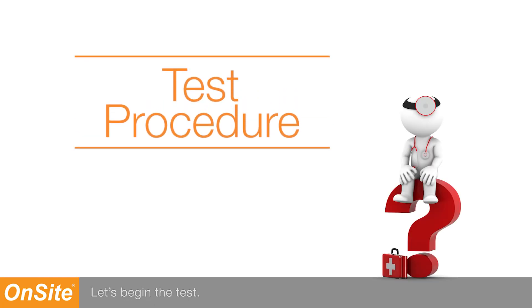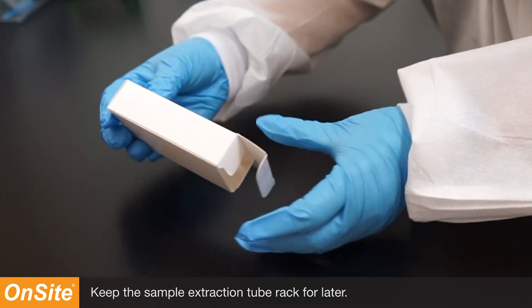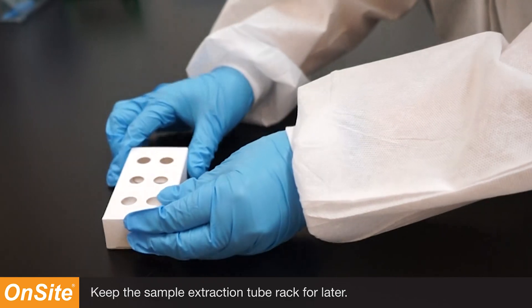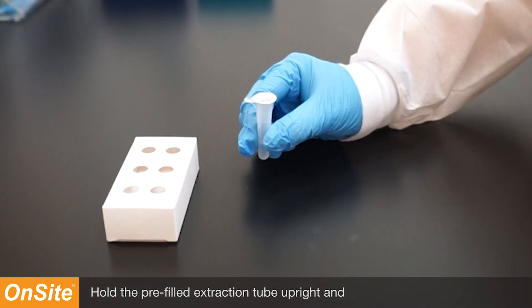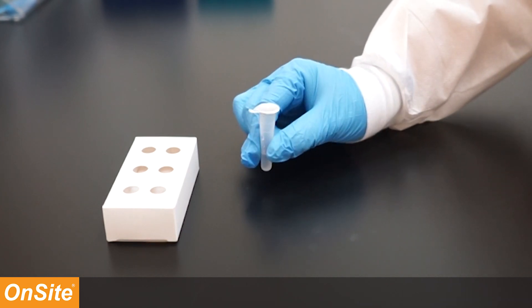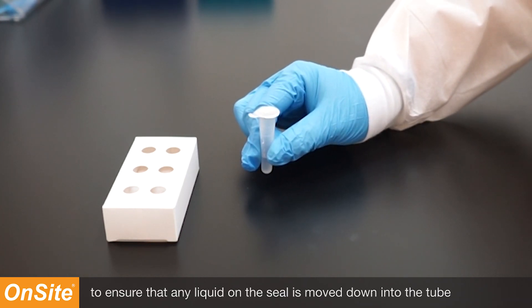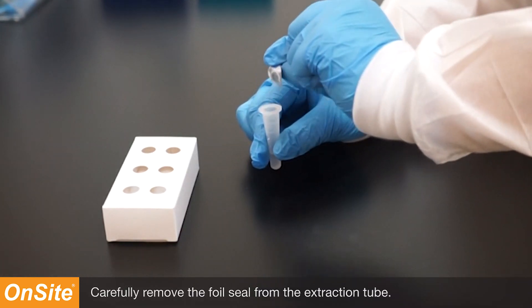Let's begin the test. Remove the test components from the plastic bag and keep the sample extraction tube in the rack. Hold the pre-filled extraction tube upright and tap the bottom of the tube on a clean, flat surface to ensure that any liquid on the seal is moved down into the tube. Carefully remove the foil seal from the extraction tube.